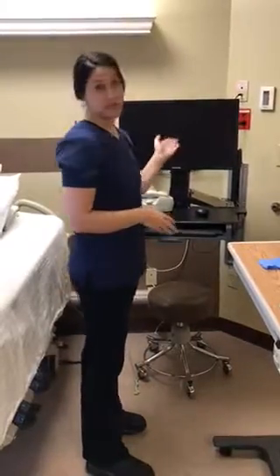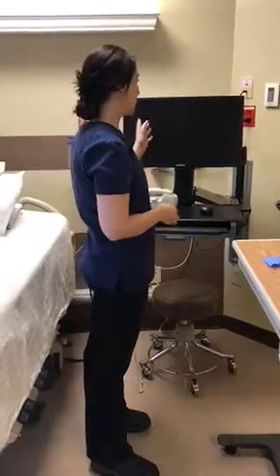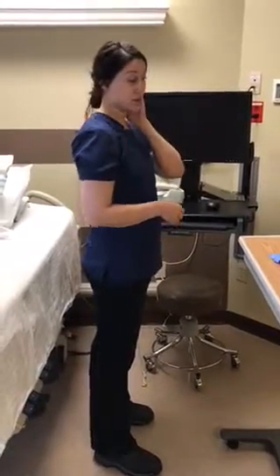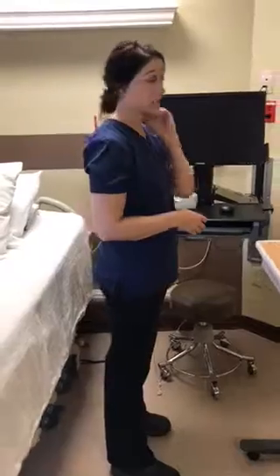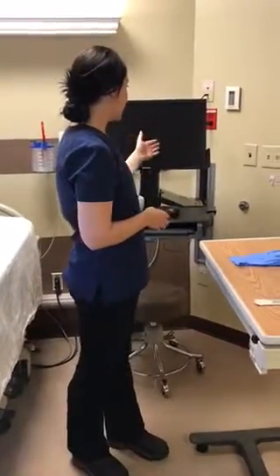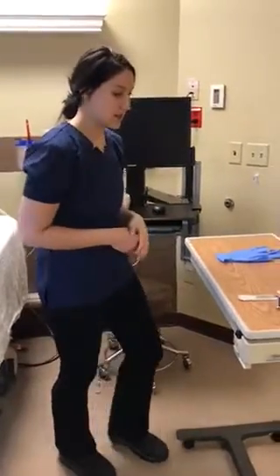and see that room 115, Bob Johnson, has an order in there from Dr. B for 10 units of U100 Humulin R. So I see that that is in there. I see that it has not been given, so it is time to give it right now.